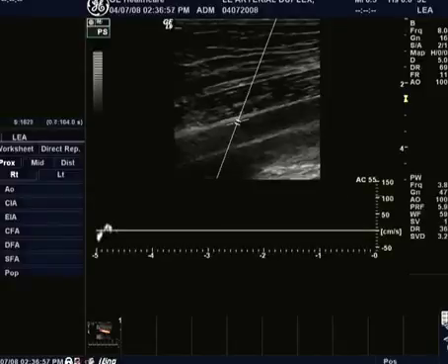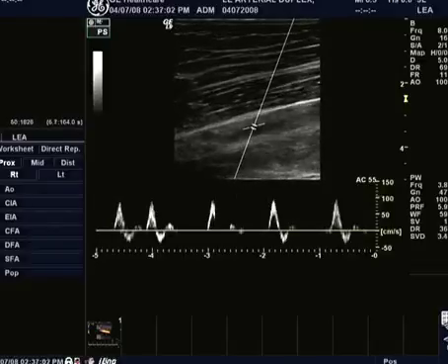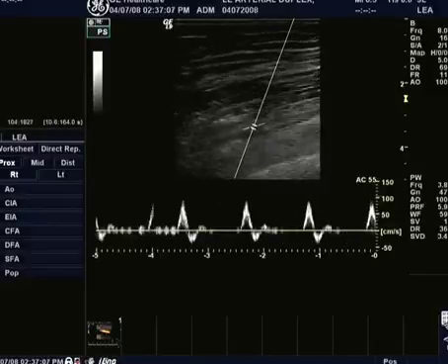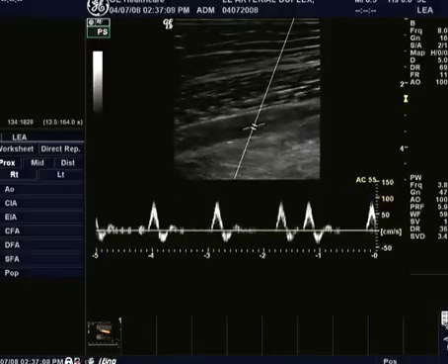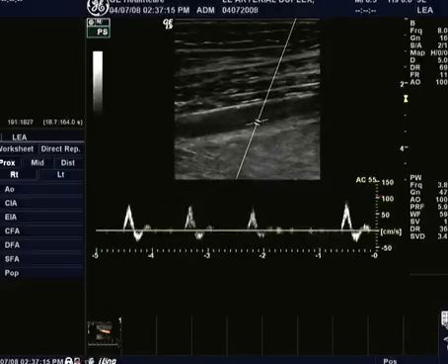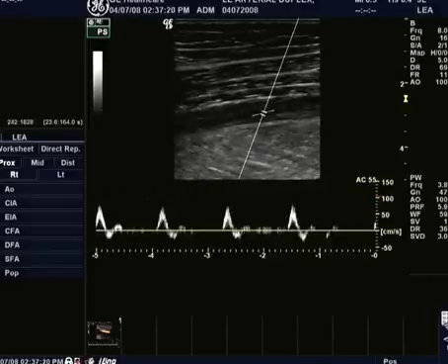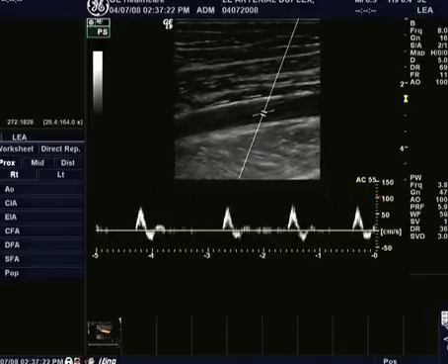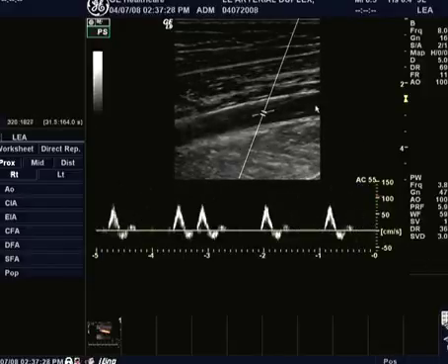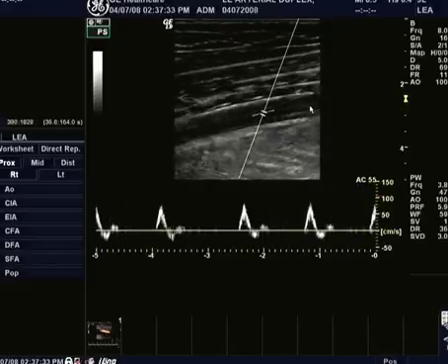At this point, I'm going to put in our spectral Doppler, and we've got a proximal SFA signal already, and we're still seeing this very nice, very healthy, triphasic superficial femoral artery signal. And we're just going to scan down the leg. A lot of times when you do this, you don't even look at the patient; you're looking at the system and moving your hand to adjust the image so you see what you want. Basically, what I want to see is this type of image where I've got the vessel right across the screen. And I'm doing a little toe-heel again so I keep a decent angle.